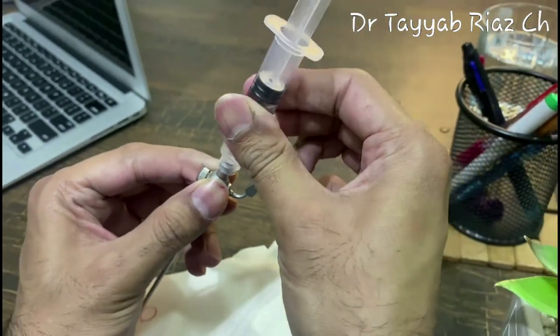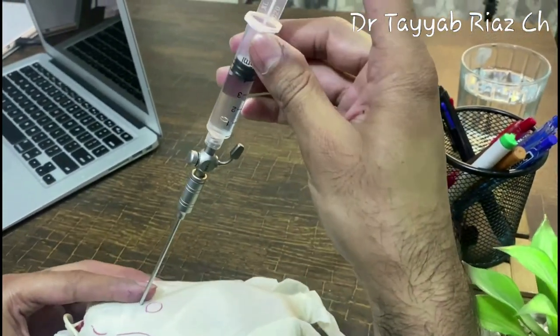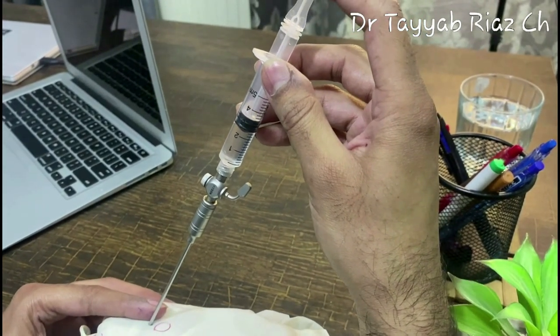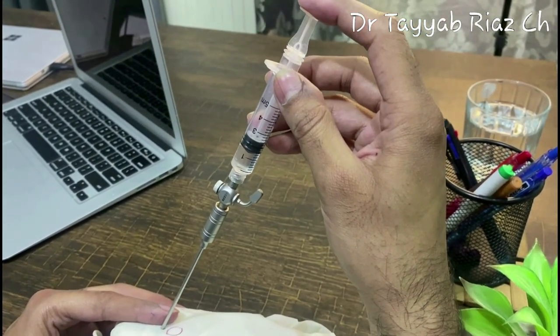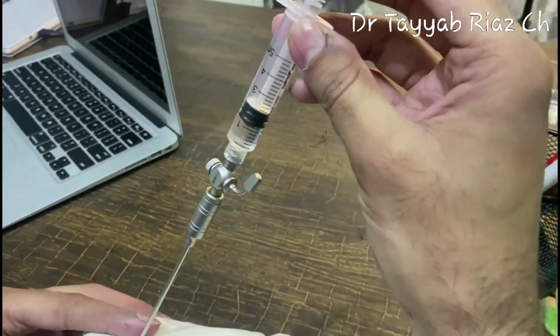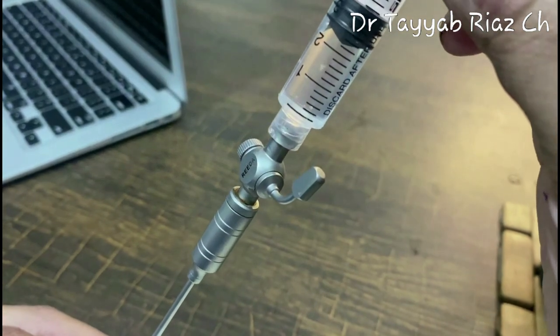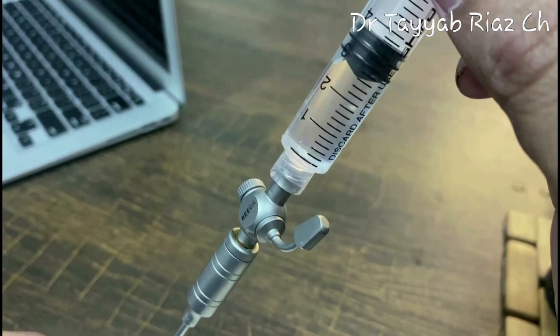After attaching the syringe, I will inject the saline through the Veress needle. It will get easily injected whether you are in the preperitoneal space or in the intraperitoneal cavity. But if you pull back the plunger, if the same saline is coming back, then it means you are in the preperitoneal space, because it is a potential space. Fluid will not get away from this space, it will come back into this syringe.